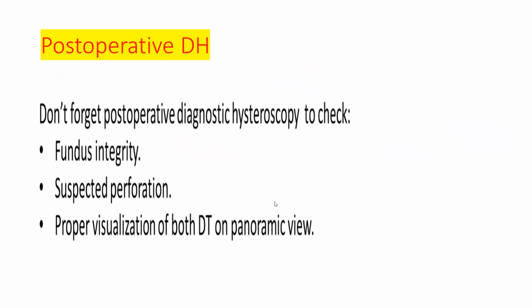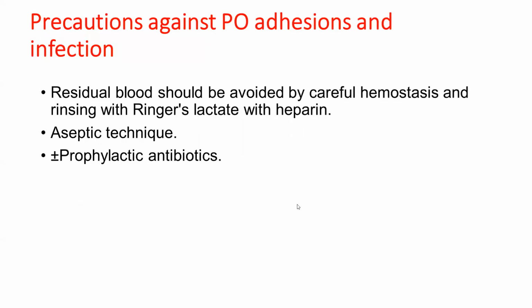Post-operative hysteroscopy is important to check the fundus integrity, exclude perforation, and ensure proper visualization of the Darwish triad on panoramic view. Lastly, if you see a lot of bleeding after your procedure or you used non-aseptic conditions, you have to expect that your patient may have post-operative adhesions.